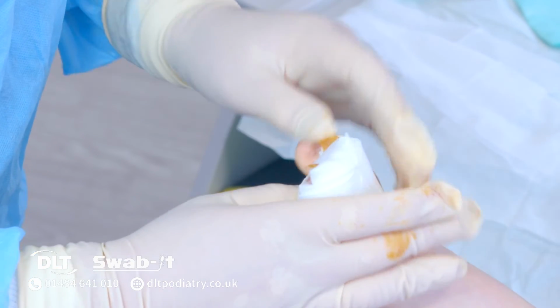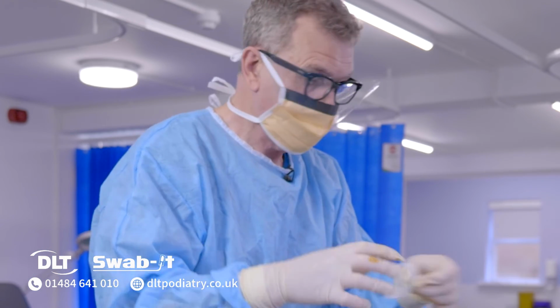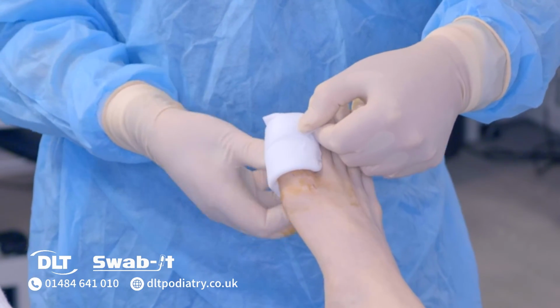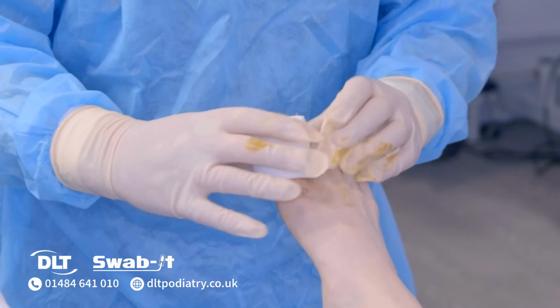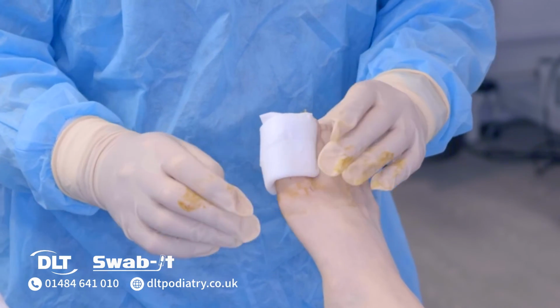You don't want to touch dressings too quick, because you will get some swelling because you've just put phenol, which is carbolic acid, on. And when you do some ingrown toenails, they might have some sort of mild infection.